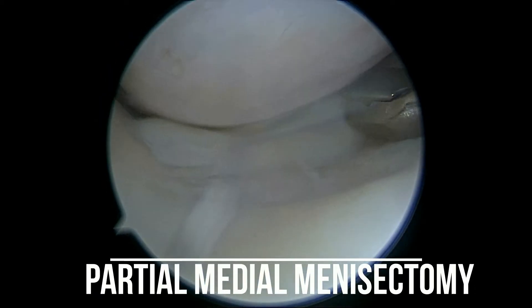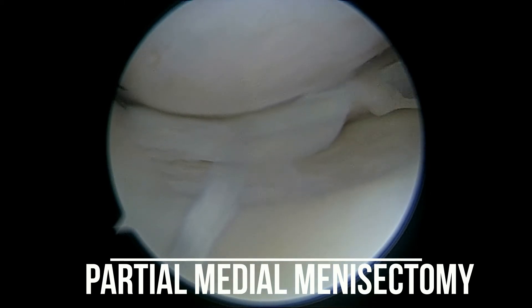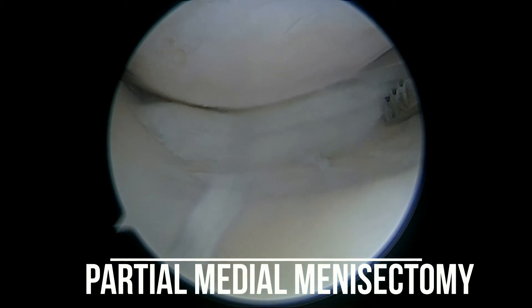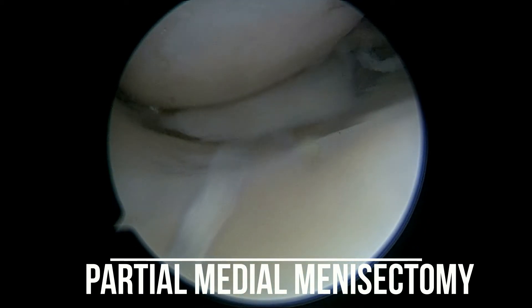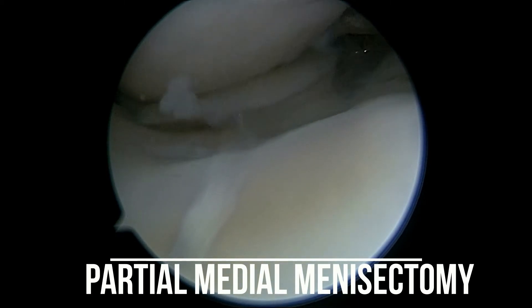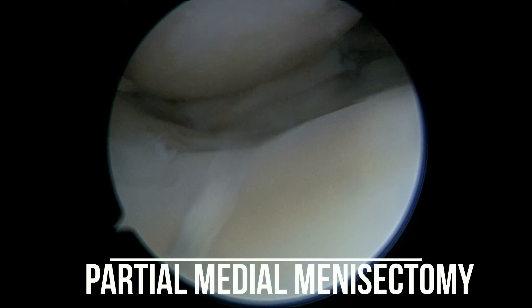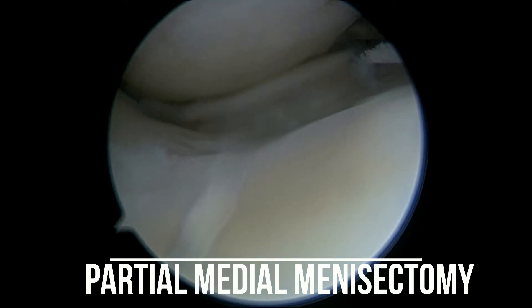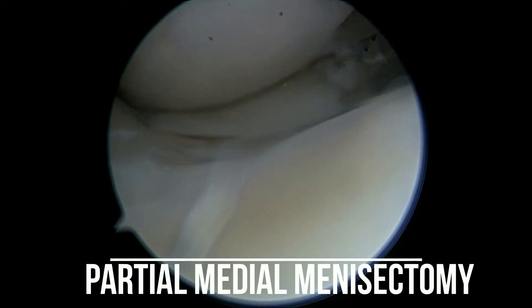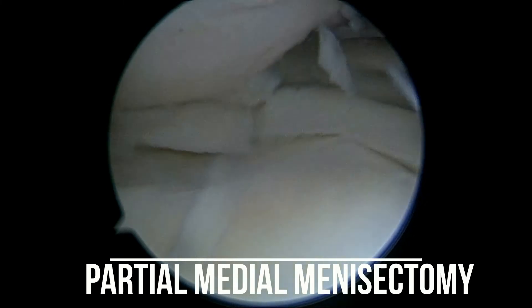Using a punch, a partial medial meniscectomy is performed, which is later shaved off. The sharp edges that may predispose to further meniscal tears are addressed with the help of a shaver. This upcut punch is used to remove the torn portion of the posterior horn of the medial meniscus.